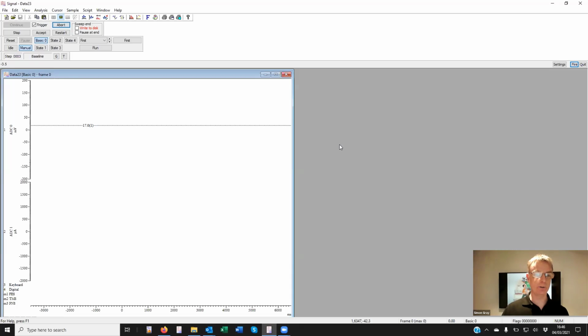Now, more than that, we transfer some waveforms into the 1401, and we can play those waveforms out on the DAC. We're using those to give auditory information to the subject. And in this case, it's going to tell them to get ready and then to go. The basic experiment originally was that when they're told to go, they'd be holding a ball. They drop the ball, it measures the EMG, and if the EMG crosses the threshold, then the sequencer will provide stimuli electrically and magnetically.